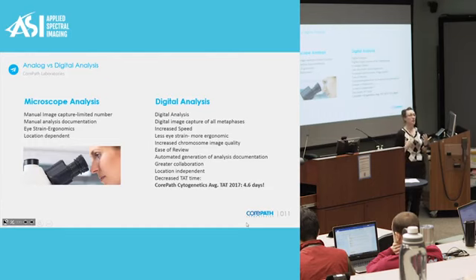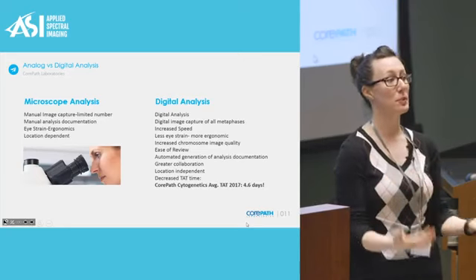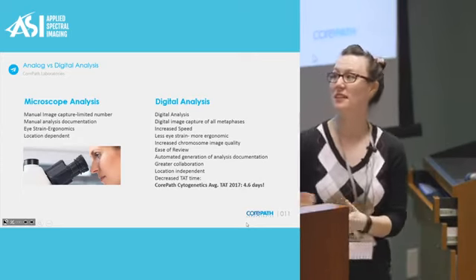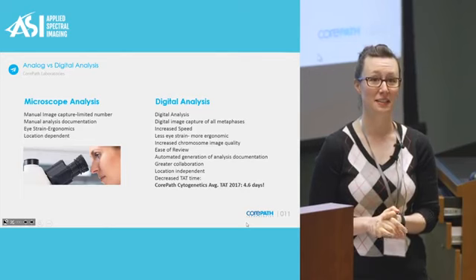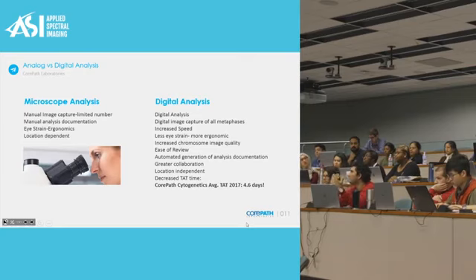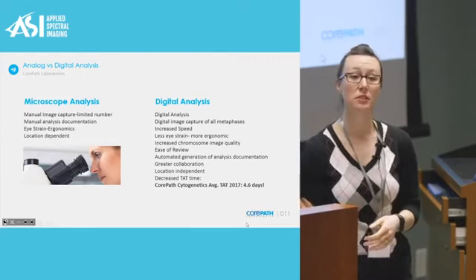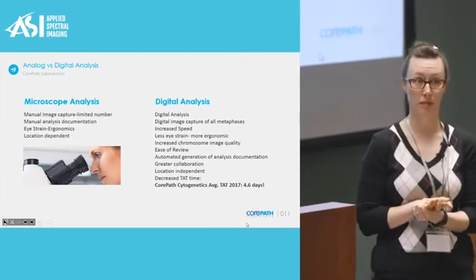And at the end of the day, this is decreasing our turnaround time, which is increasing the rate at which we can get results to people. Because you wouldn't want to be sitting around waiting for results, would you? This is someone's life. So for example, since we're using digital technology, our turnaround time for a cytogenetics case last year was 4.6 days. That's pretty impressive. What would you say is the standard without, say, digital systems? Somewhere between 7 to 10 days on average. Now these are for bone marrows and peripheral bloods. These are not constitutional cases. These are oncological cases, just to clarify.